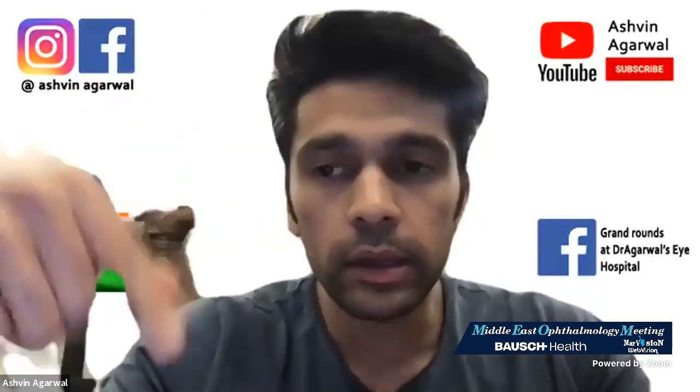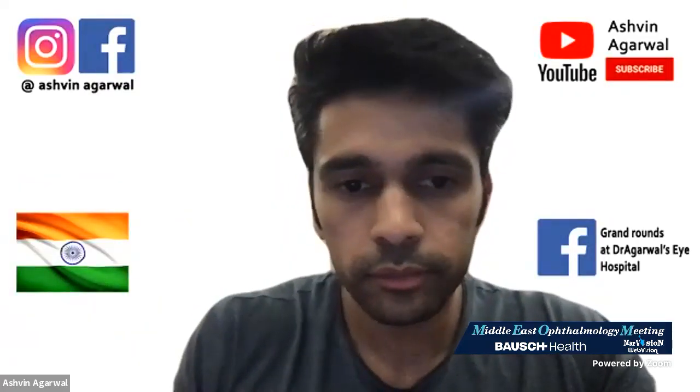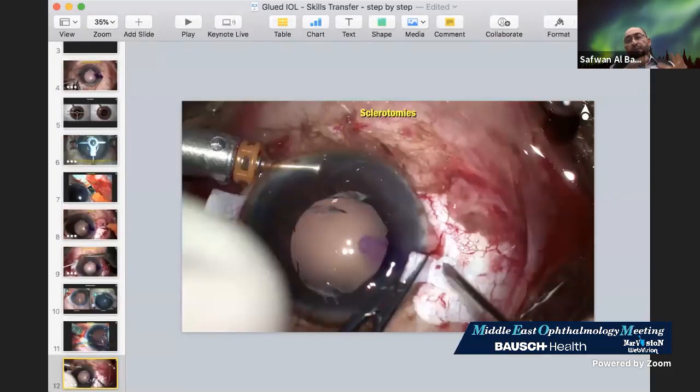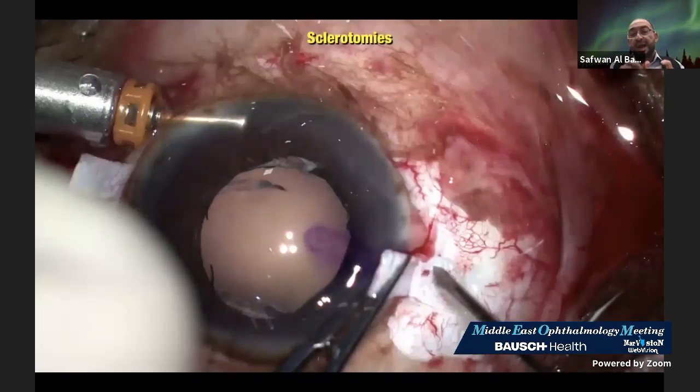I hope I'm getting this through. Yes, and it is exactly like that. This is one of the keys of success for this surgery, because if anyone goes beyond 0.75, extending to, for example, 1 millimeter or 1.5 millimeters, then they will have shortening of the length of the haptics to go in the tunnel. And that's one of the keys.